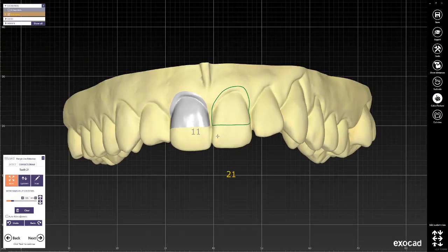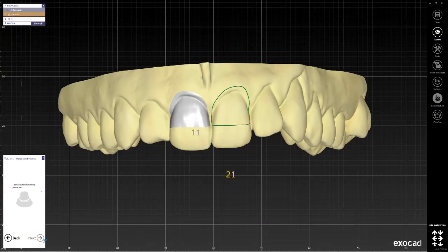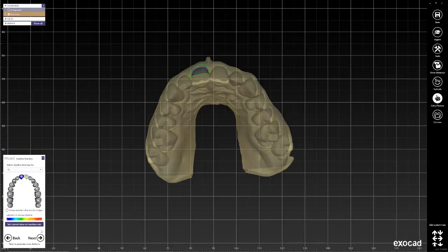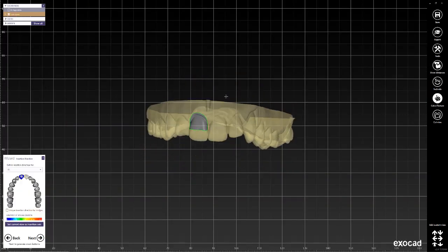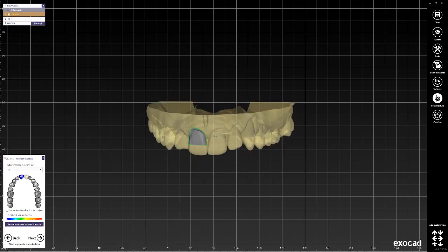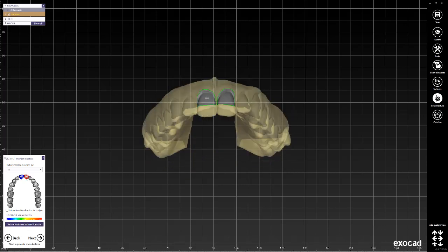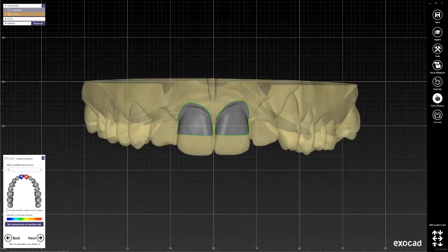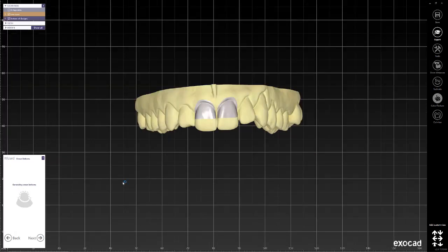Let's just pretend that this is more or less what we want. The rest of the process is pretty straightforward. The only thing we want to do here is change the insertion direction for both of them and have it be looking straight out towards the facial. We'll rotate the model to look at it from this point of view, then we click set current view as insertion axis and go to the next step.